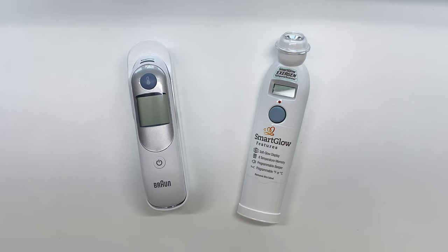Braun is also in the healthcare industry for many many years now. They also have many other products in personal hygiene such as toothbrushes and electric shavers. So these two have a long history of selling products and a credible product line.